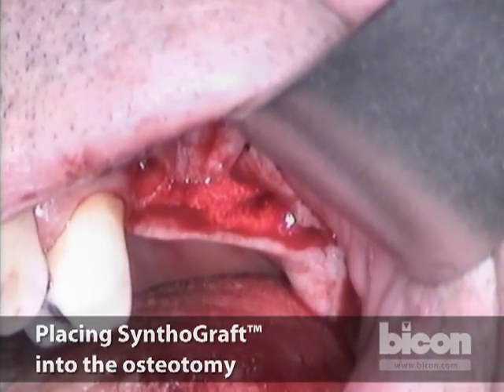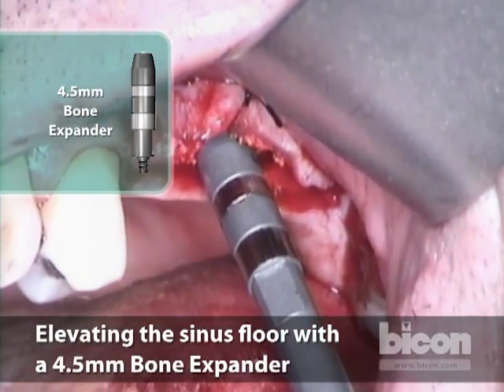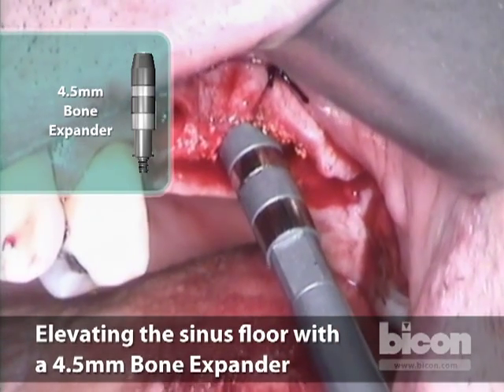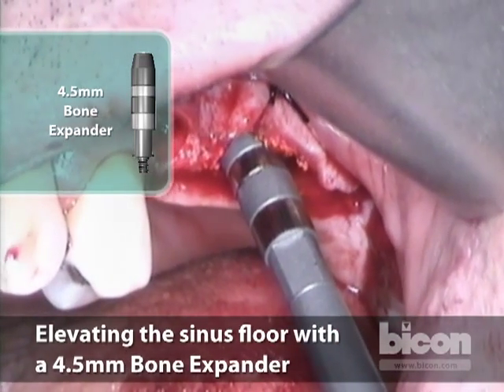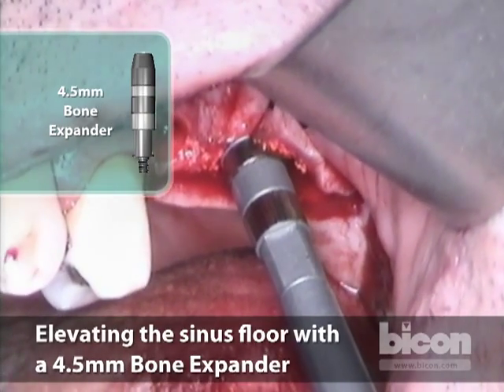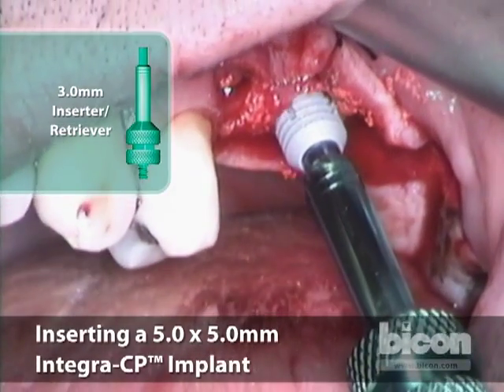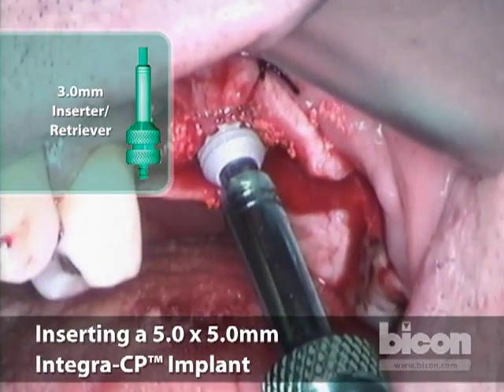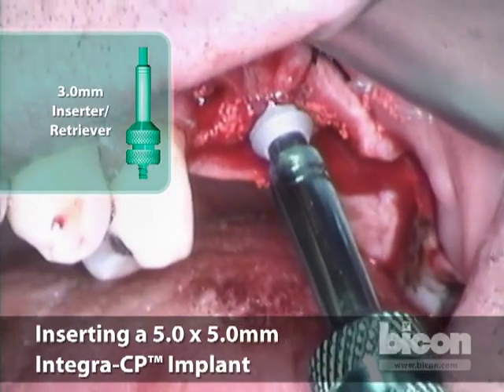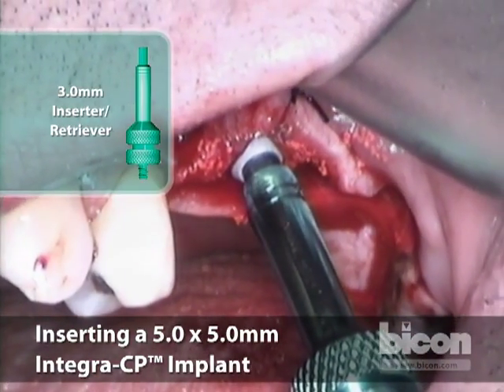We will use a smaller expander — this is 4.5mm — and start tapping it. We will probably be secure without having to resort to a sinus lift abutment, but we will see. I can gauge that with the amount of resistance I'm getting to the tapping. That's pretty tight.